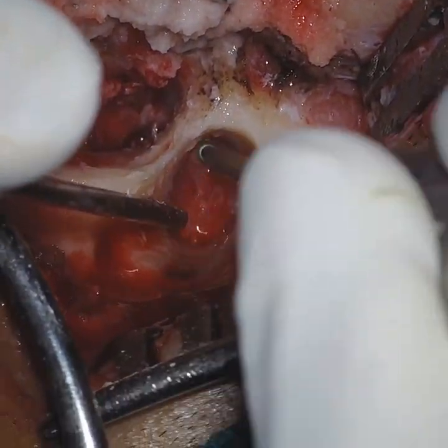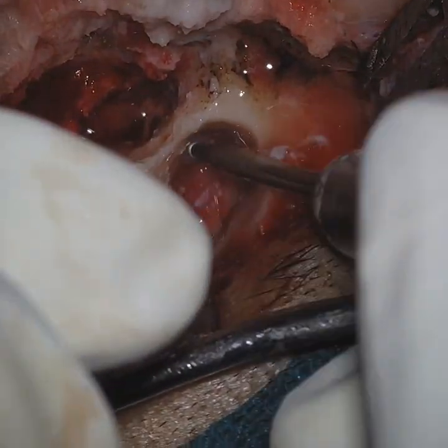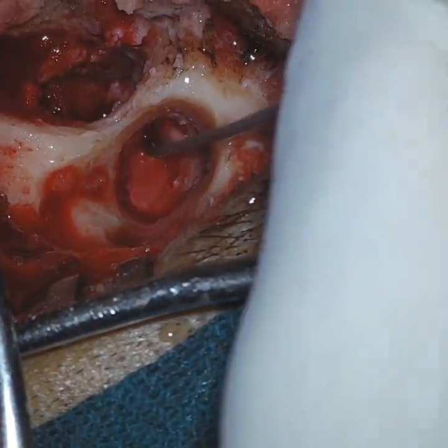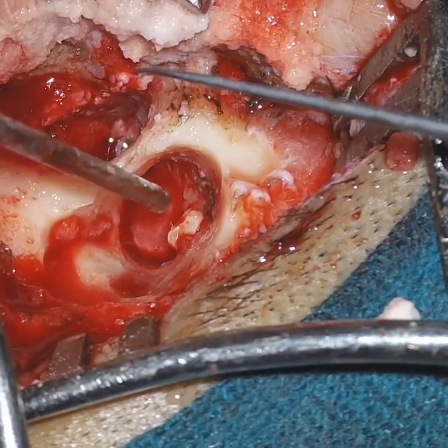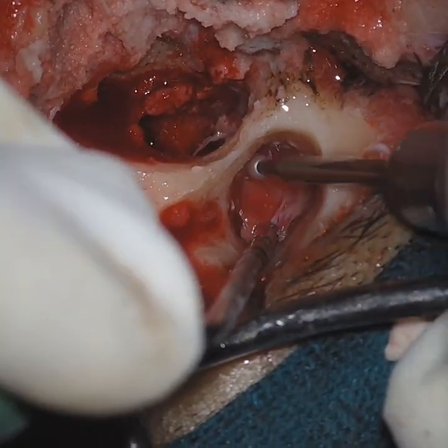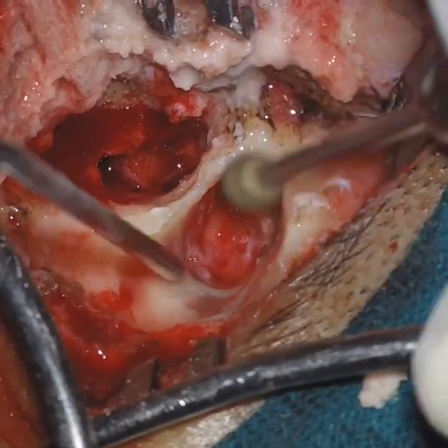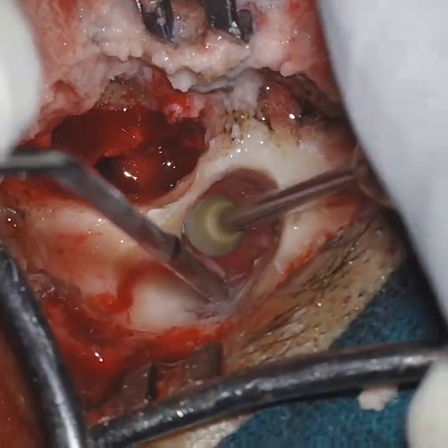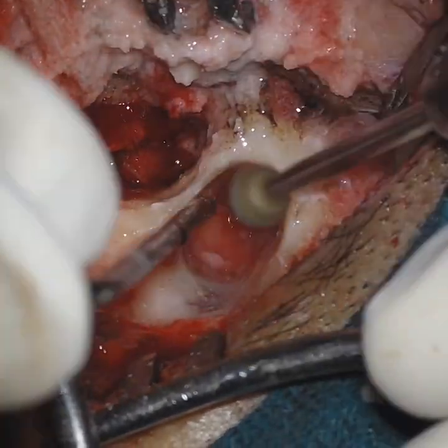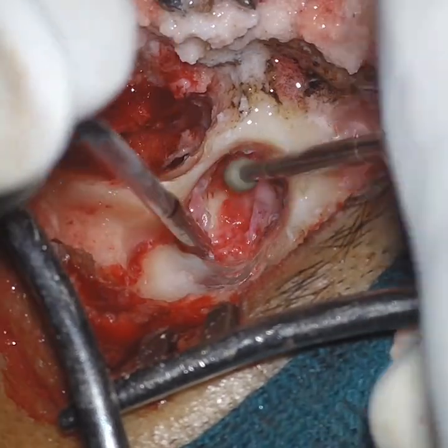So now it is utmost important to thin the canal wall adequately, and since we want to preserve the chorda, care has to be taken not to injure the chorda posteriorly in the canal wall. So now we see that the incus was eroded and it was removed. So now after removing the incus, we are seeing the hypertrophic mucosa is engulfing the lateral semicircular canal, and also it is hampering the aeration of the attic region. So we are removing the hypertrophic mucosa.